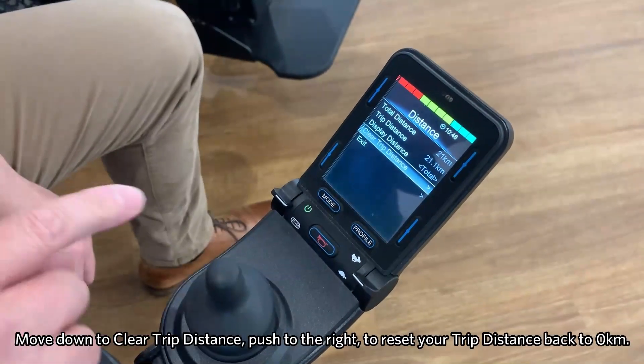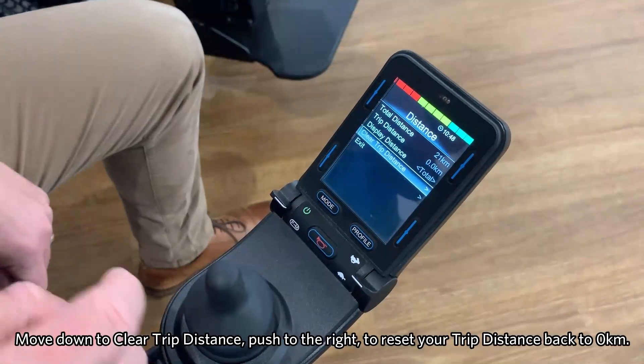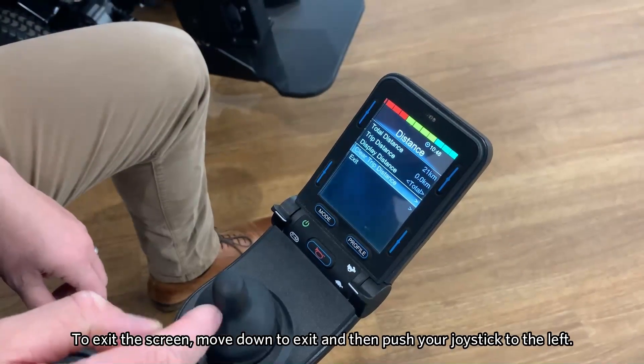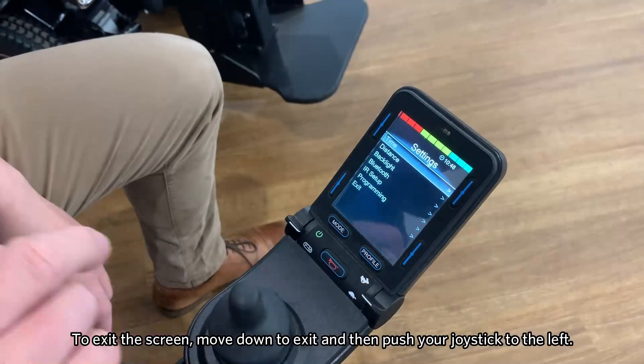If we go on to clear trip distance, we can push right into that function and as you can see, that's changed. To come out of that screen, push left to exit, and then we have the same functions in time.